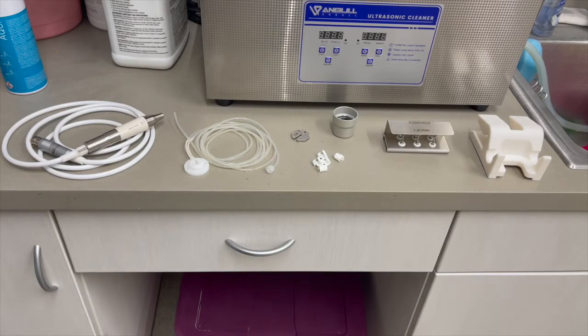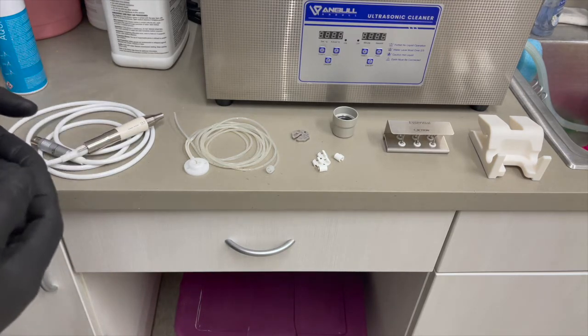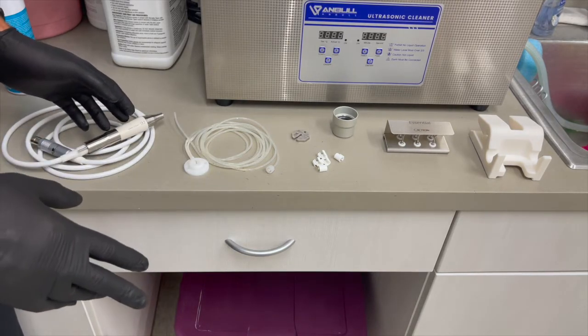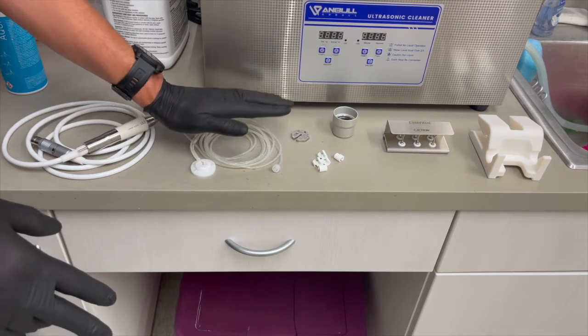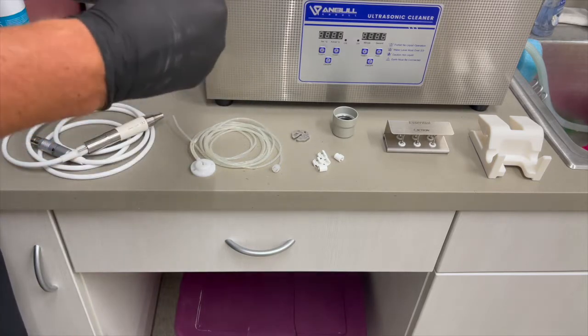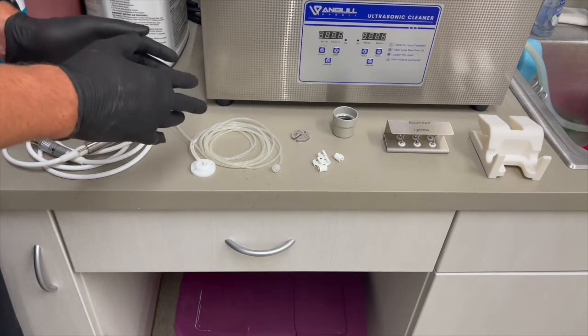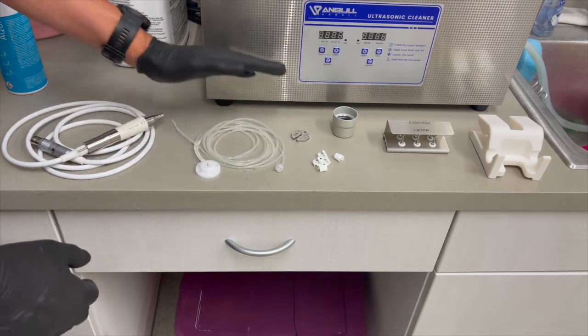The next step in the process is the cleaning step. Cleaning is done in one of three ways: either by ultrasonic, by hand, or with something like an instrument washer. Some of these items need to be done only by hand, while others can be put into an ultrasonic or instrument washer. The cleaning step is done prior to the autoclaving step — cleaning makes items free of debris, and once free of debris, we can sterilize.